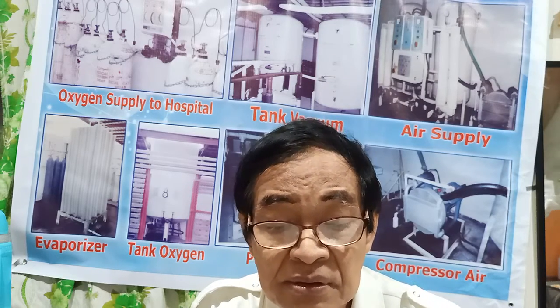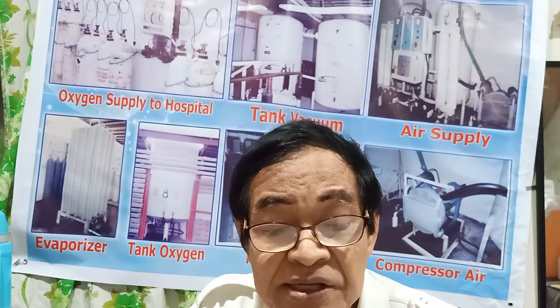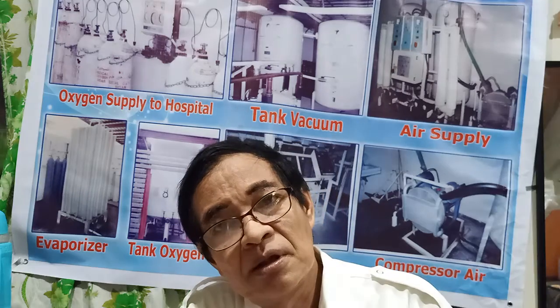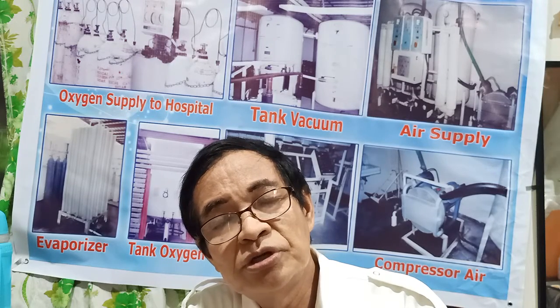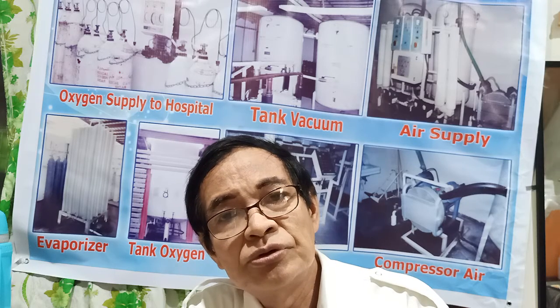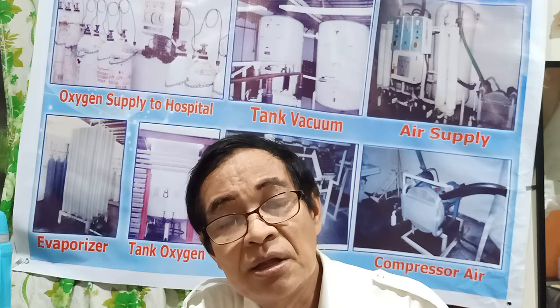This one: never release the pressure of liquid carbon dioxide. This is a means for emergency dry ice, to supply some co-workers of the hospital.